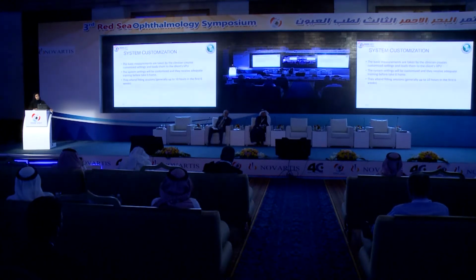The system is customized based on measurements taken by the clinician, who creates customized settings and loads them to the patient's VPU. The system settings are customized, and the patient receives adequate training before taking it home. They attend fitting sessions, generally around 10 hours in the first 6 weeks post-surgery.